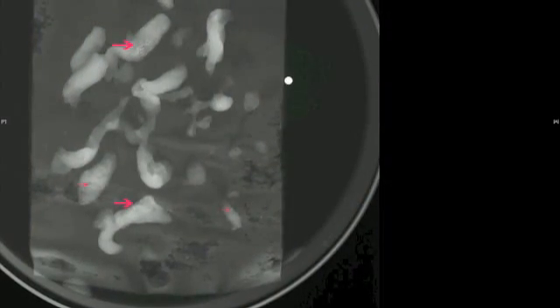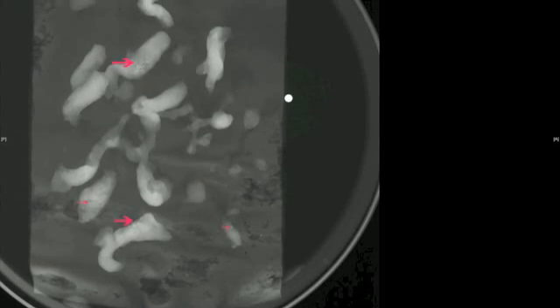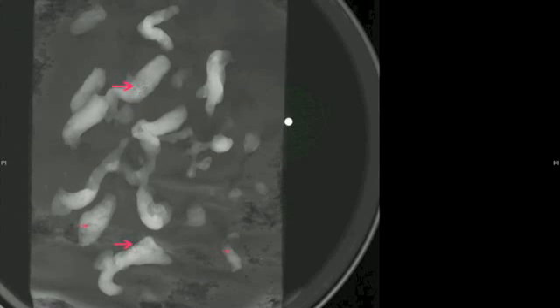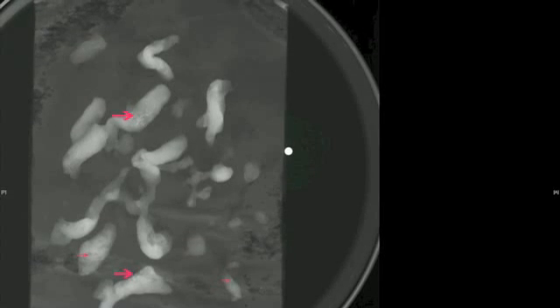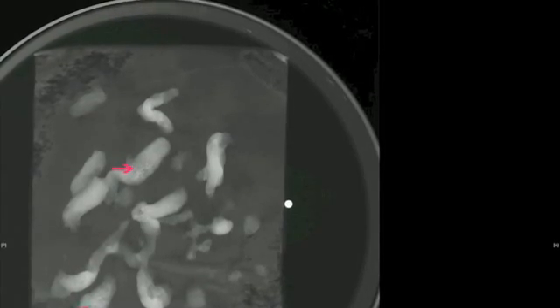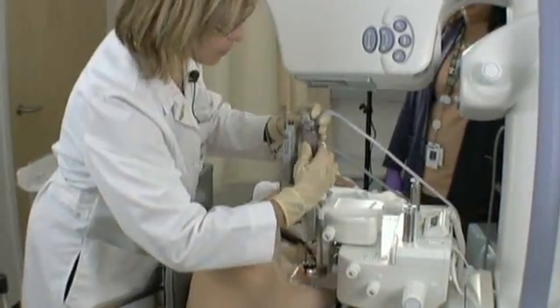This is the specimen radiograph, obtained while the patient is still on the table. It confirms the presence of targeted microcalcifications in multiple samples. The samples with microcalcifications are placed in a formalin jar separate from the samples without microcalcifications — all tissue is submitted to pathology. The specimen radiograph showed beautiful calcifications in the samples.